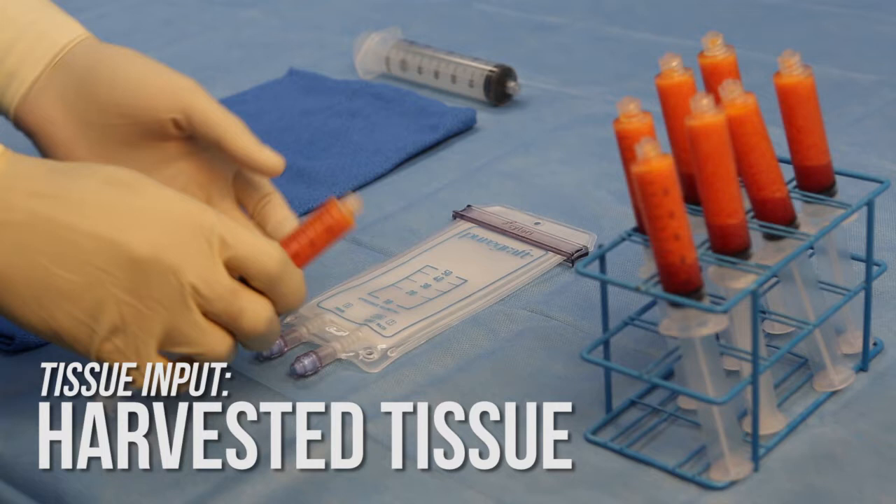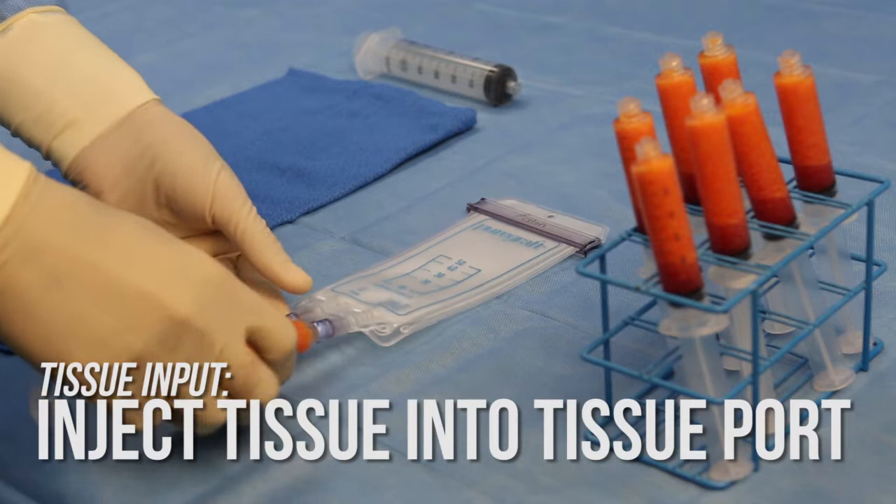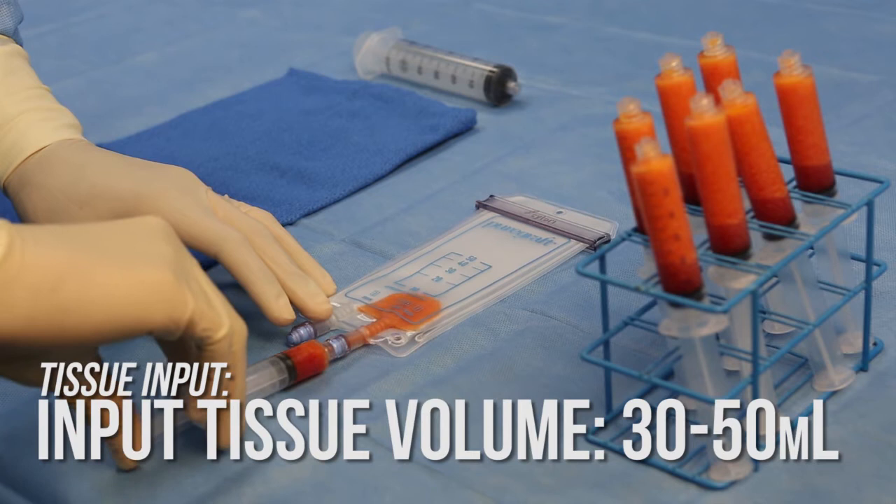To begin graft preparation, take the harvested tissue syringe and inject the tissue into the PureGraft 50 system through the tissue wash port. The PureGraft 50 system processes between 30 and 50 milliliters of tissue. Do not exceed 50 milliliters of input tissue at any time.